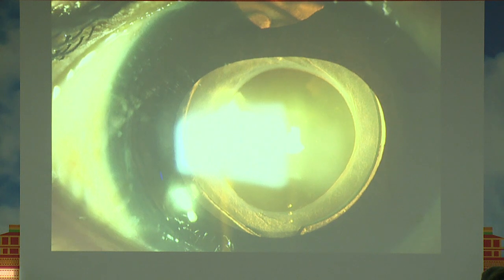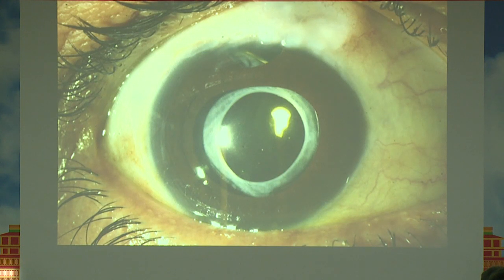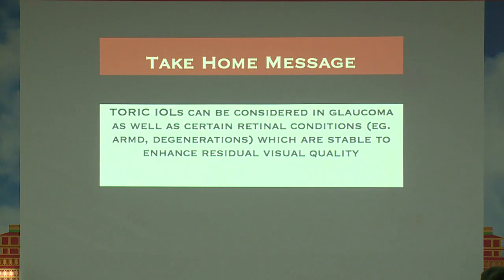I mean, you have to understand that the PI has to be covered by the lid margin. And with that, I think this is probably one of the advantages of a toric IOL, that it's just a monofocal lens with an added astigmatic profile. And if you can take off that much handicap from the patient's eyes, particularly in diseased eyes, I think there is no harm in putting these lenses in these patients. And I think in our hands, it has worked out very beautifully for these eyes. So a take-home message for glaucoma is it can be considered.